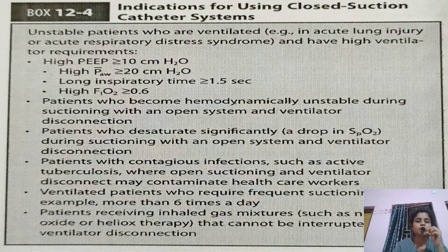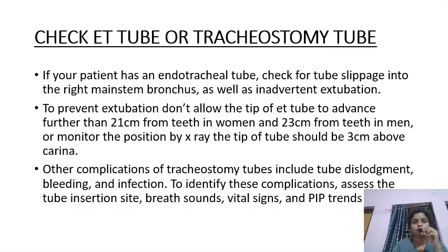This is used in anesthesia. In those cases, closed suctioning should be used.